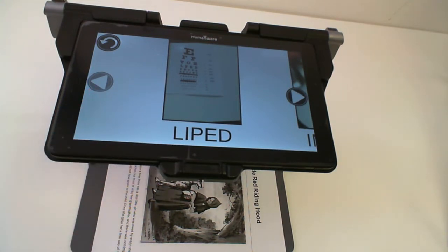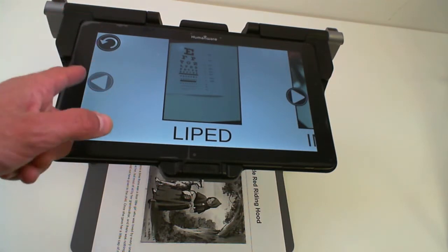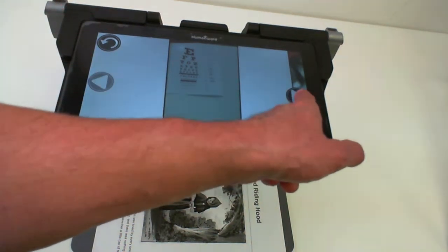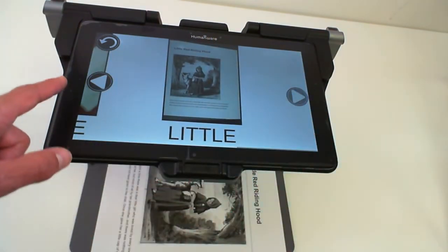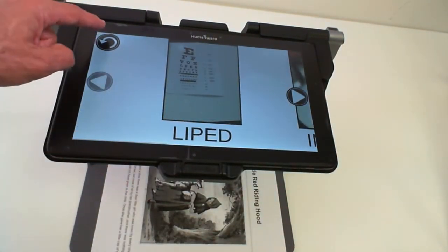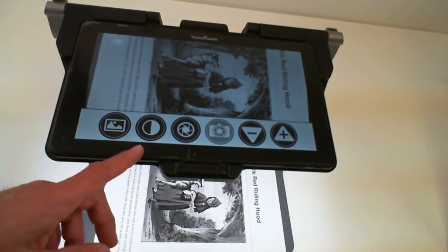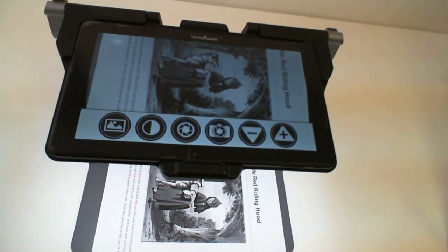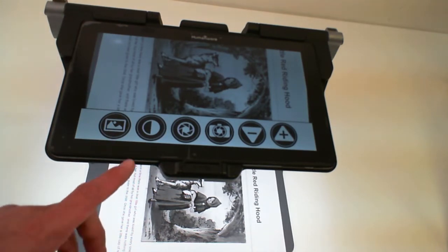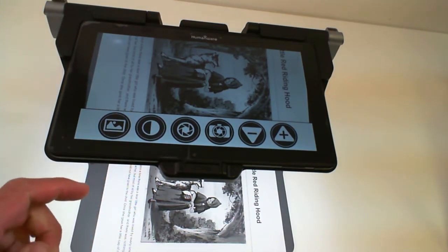If there is more than one image in my Gallery, I can use the arrows on the right-hand side and the left-hand side to scroll through my images. I can still use my finger to scroll as well. The second button from the left is the Contrast button, which will loop through set contrast colors that is set by your teacher or the user.